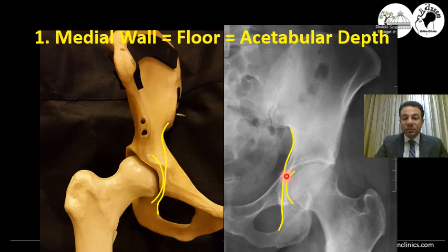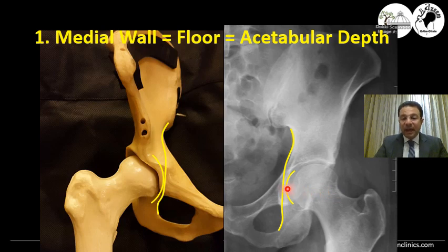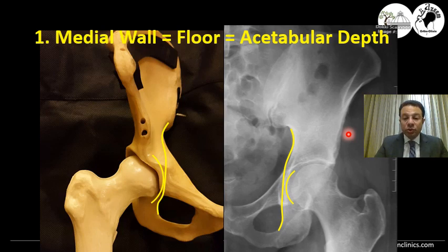If this medial wall is protruding, touching, or medially protruding beyond this line, that means that the acetabulum is deep and the cave is deep. That means that either you have a coxa profunda — a huge acetabulum — or a protrusio acetabuli, meaning that the head is protruding into the pelvis.